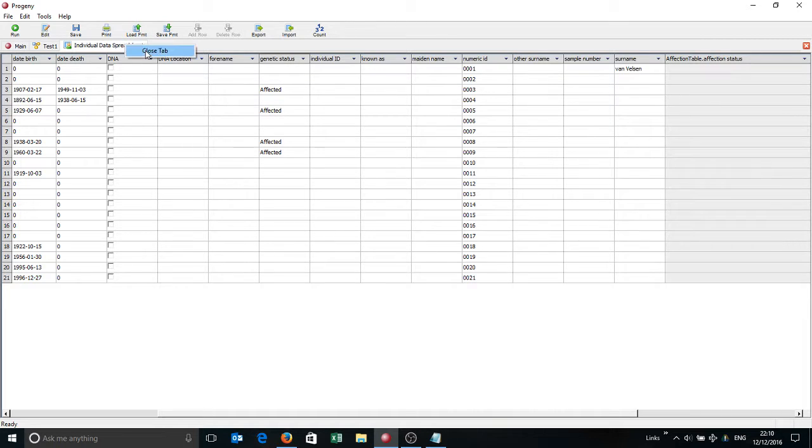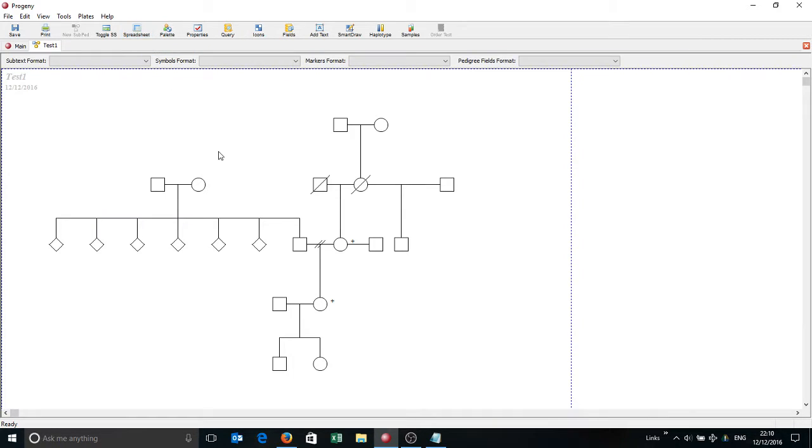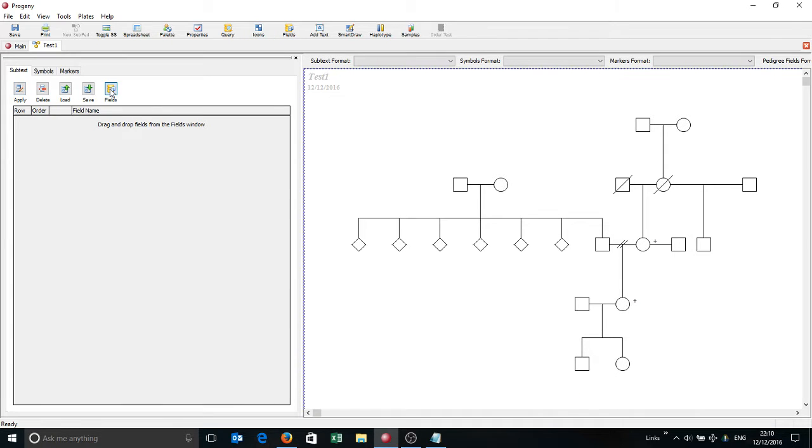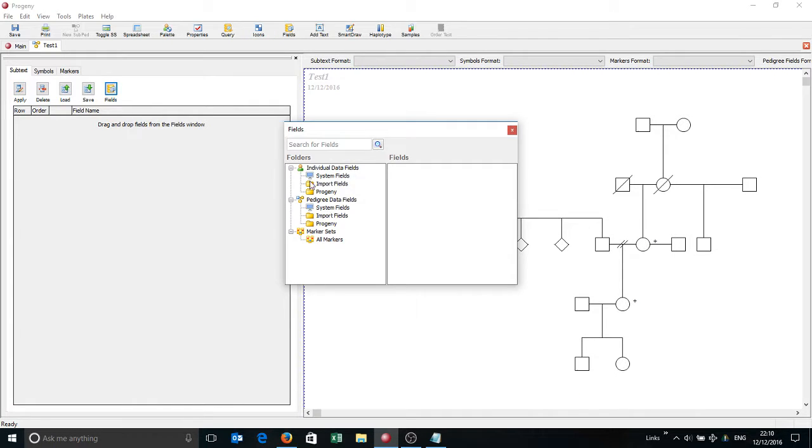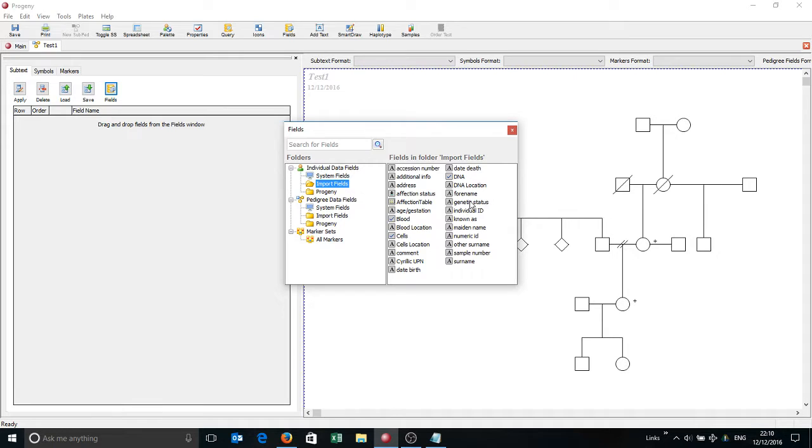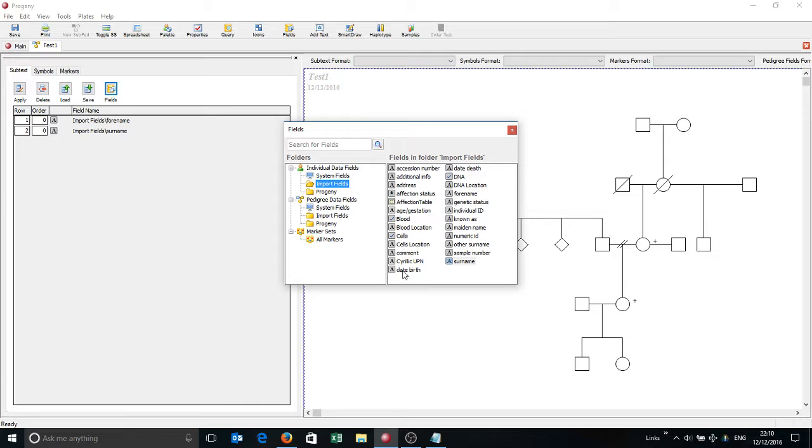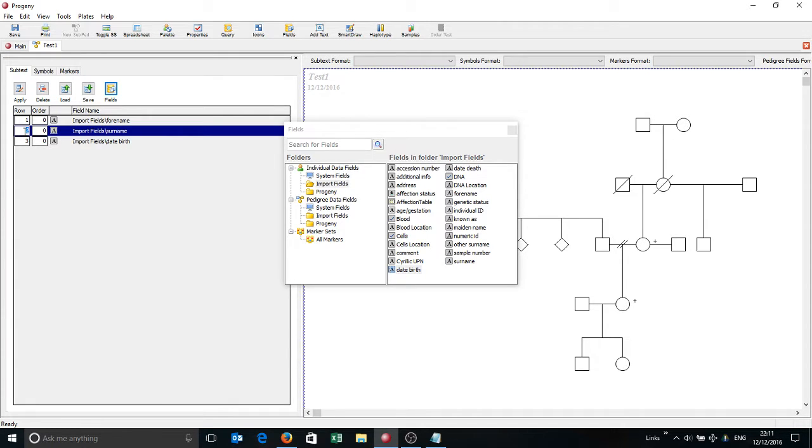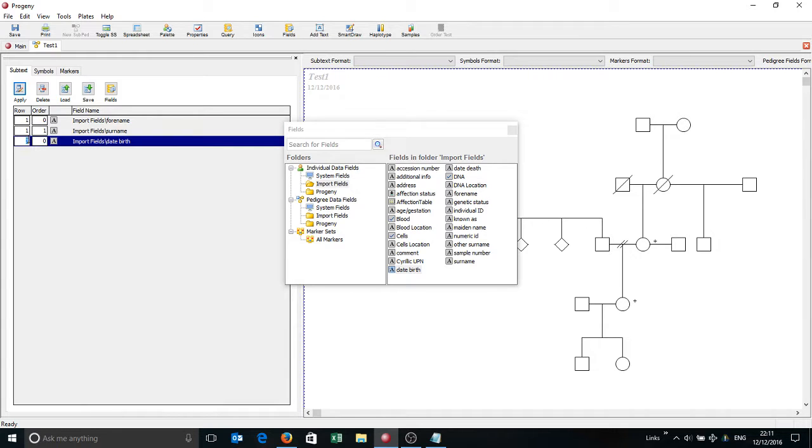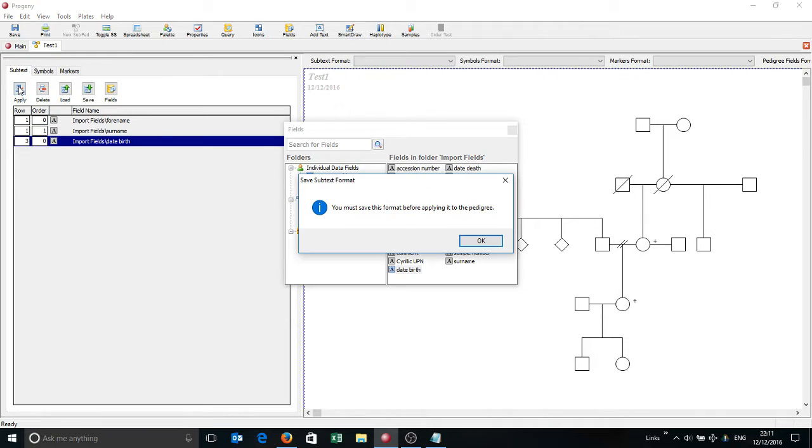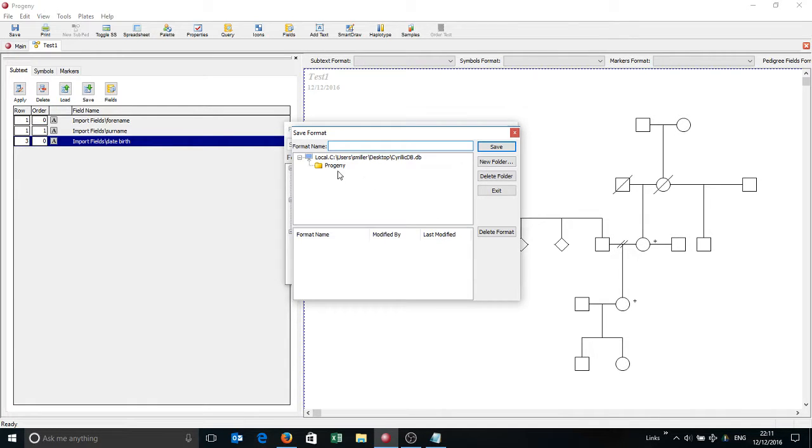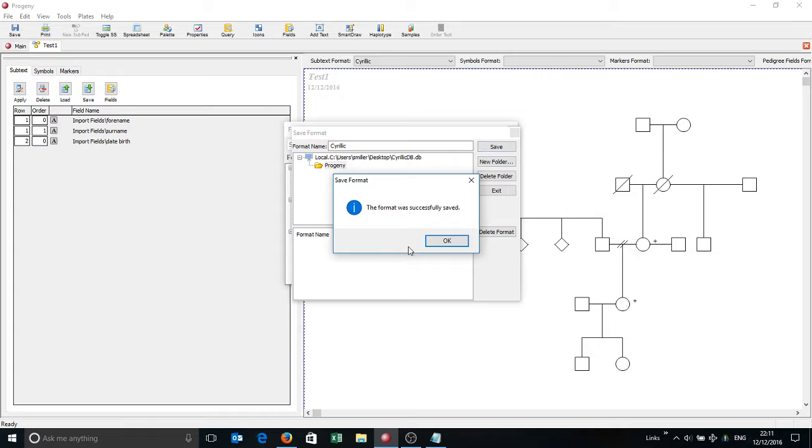So first thing we can do is click on the icons button here. And I'm going to show at least the first name, forename, surname. And in this case I'm going to choose the date of birth as well. I'm just going to reformat this slightly so that forename and surname show next to each other and date of birth shows just underneath that. So I'm going to click apply. It's going to prompt me to save this format. So I'll simply save that as Cyrillic, like so, and save.